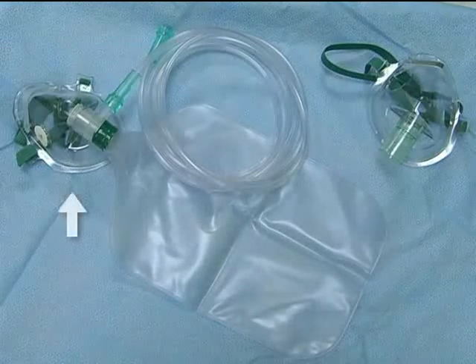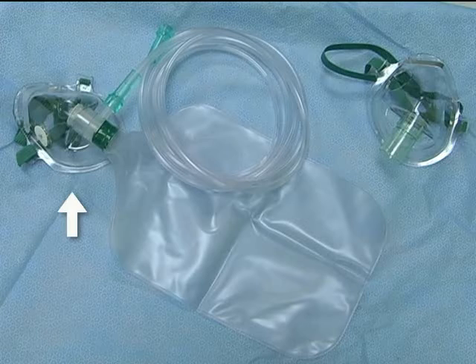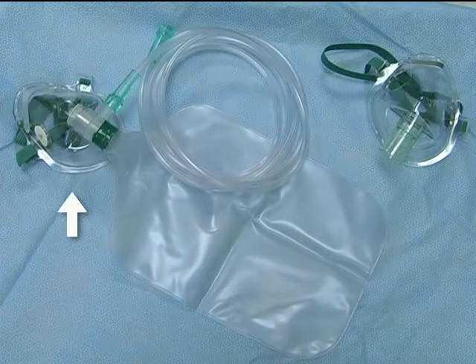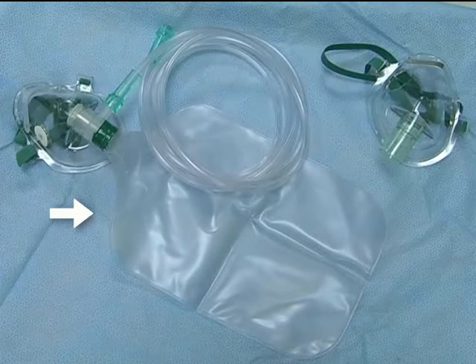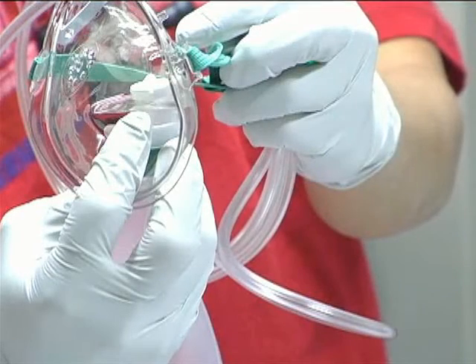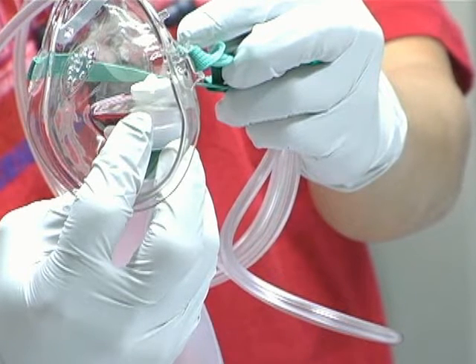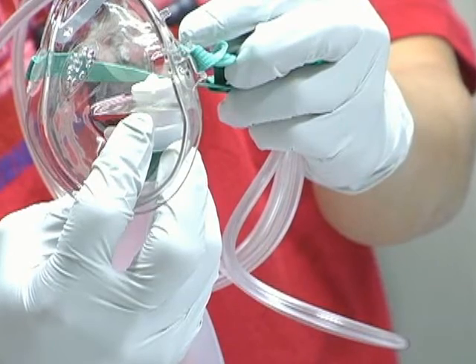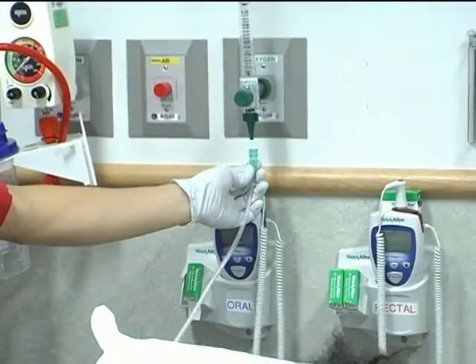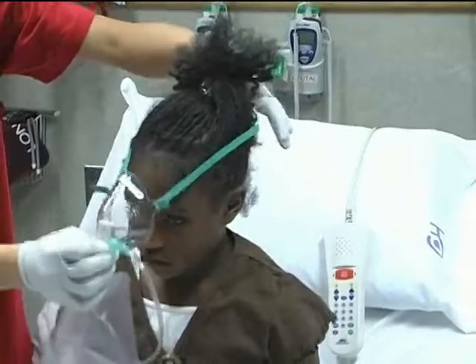A partial non-rebreathing mask is able to deliver higher effective oxygen concentrations than a simple face mask. A partial non-rebreathing mask has a reservoir bag and one-way valve to reduce rebreathing of exhaled carbon dioxide and deliver a more oxygen-rich source during breathing. Always make sure that a non-rebreather mask is connected to a continuous oxygen source.